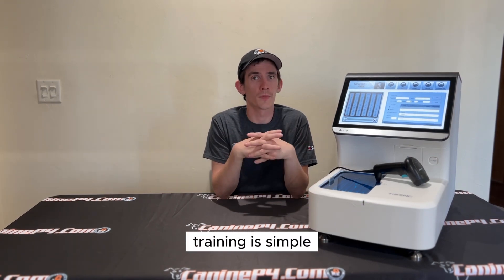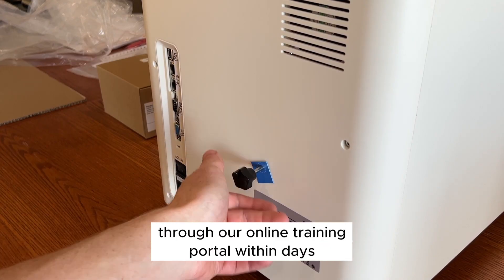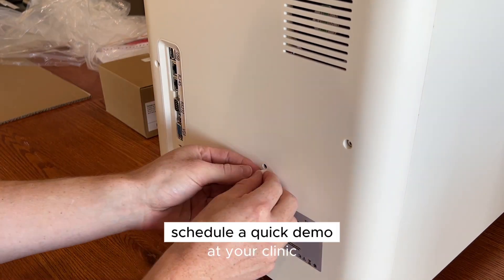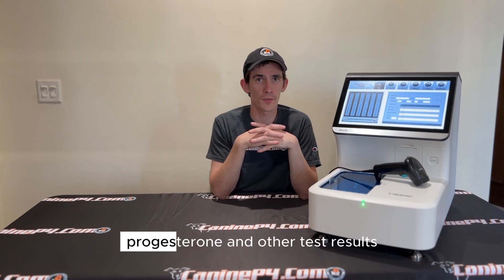Training is simple. You can buy this device and be ready to go through our online training portal within days. Get your team together, view the training videos, schedule a quick demo at your clinic, and be underway to running accurate progesterone and other test results.